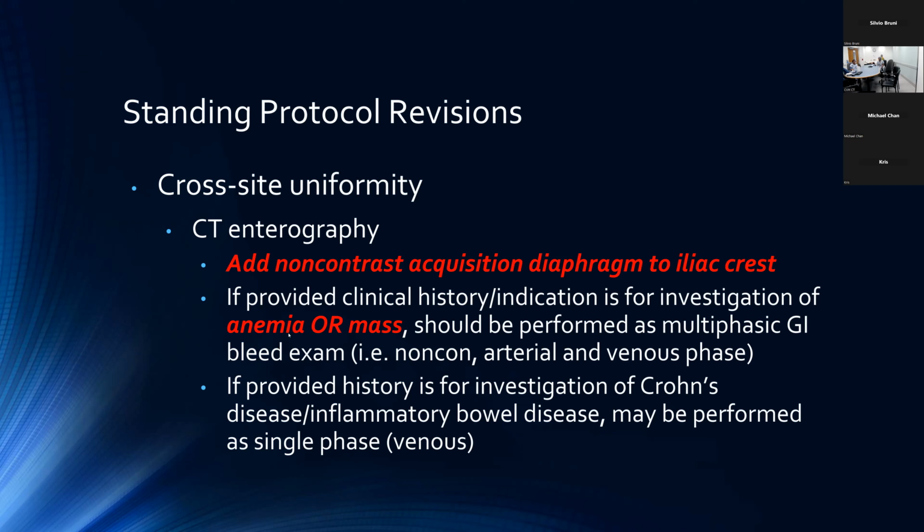But when it comes to evaluating for anemia, so looking for extrav or looking for masses, bowel masses, having those multiphasic images is quite useful in terms of increasing our sensitivity and accuracy. So please ensure that if it is for those indications that we're doing the multiphasic exam.